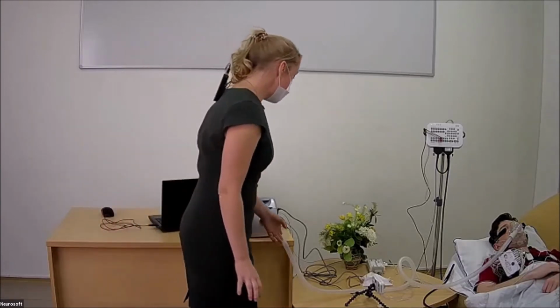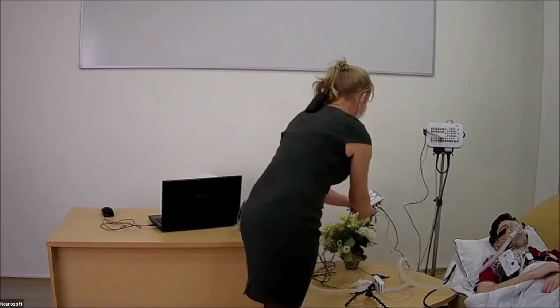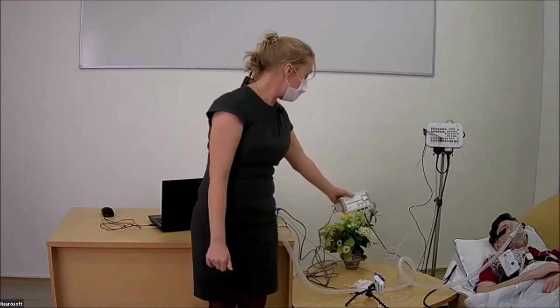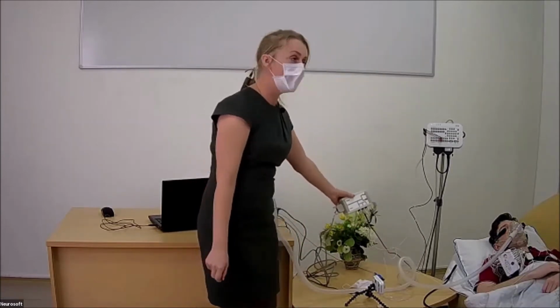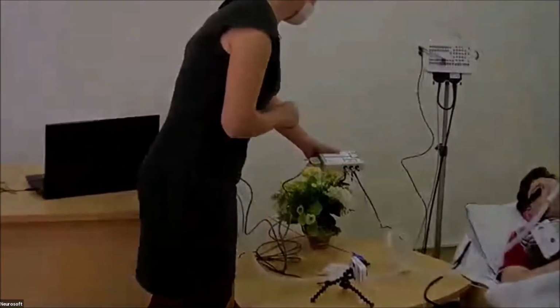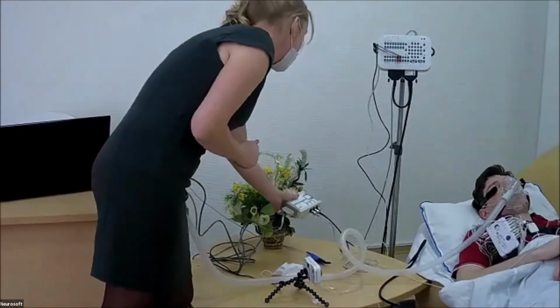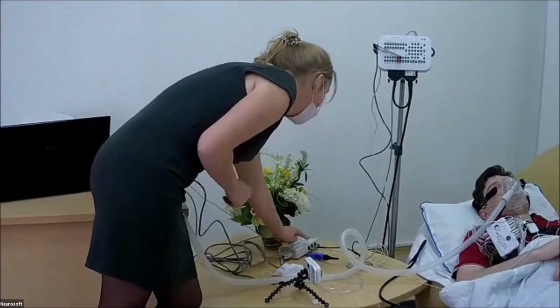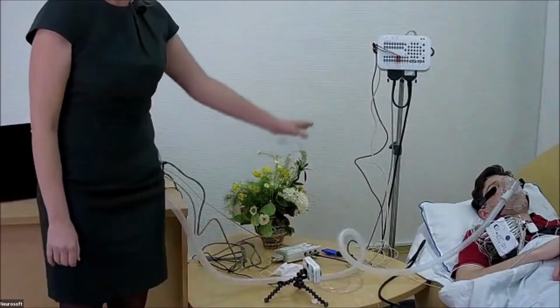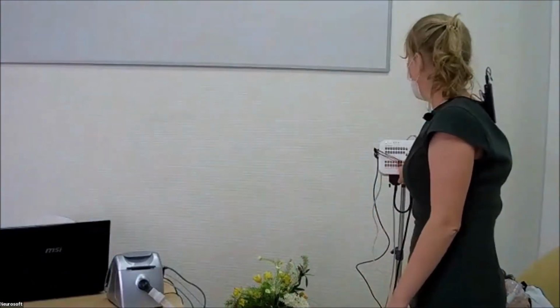So this module has different outputs here, and in our case, these outputs are marked as pressure, flow, and leakage, and we can connect these outputs to the DC channels of our system.